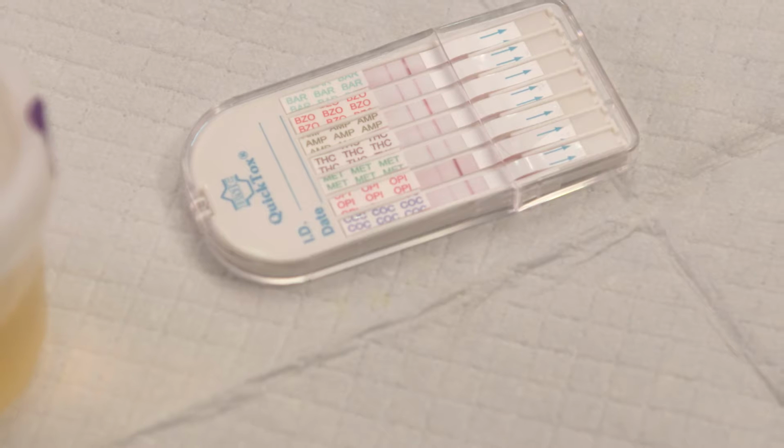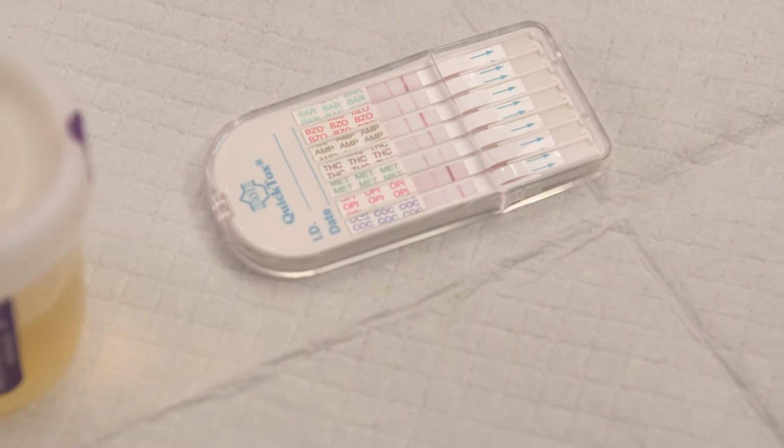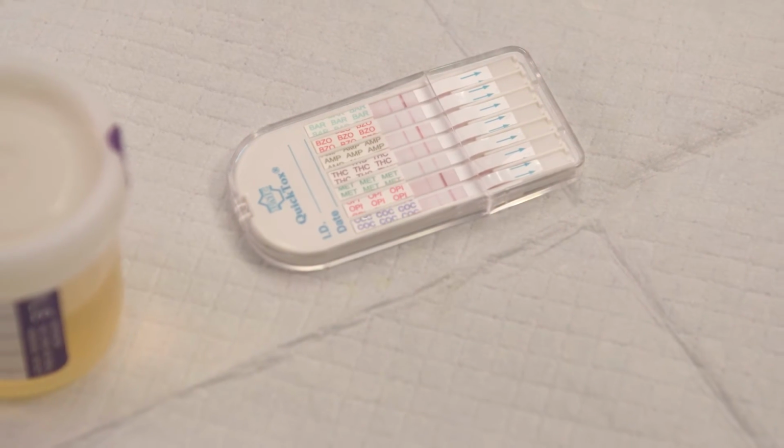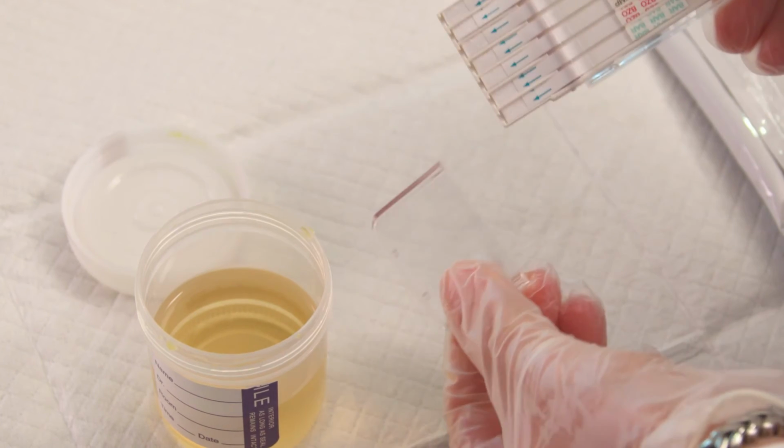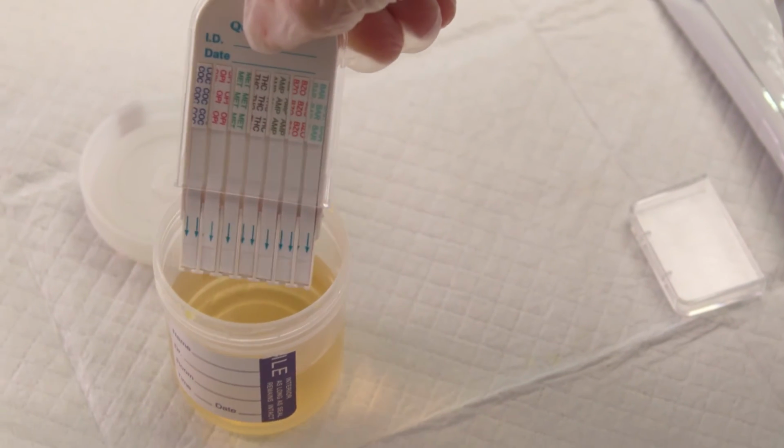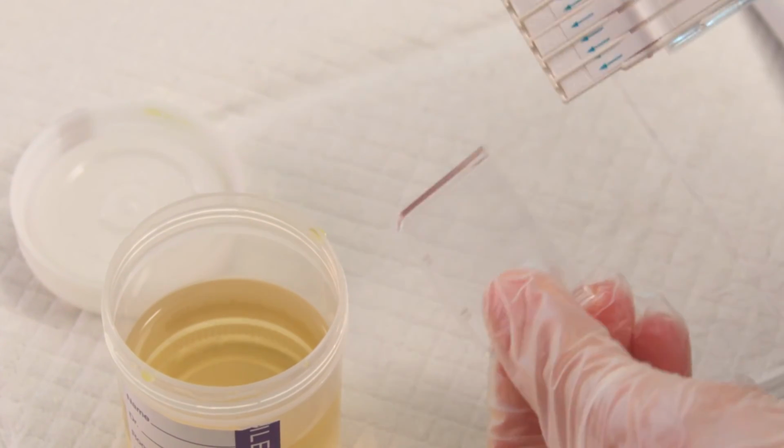Now, let's think for a minute about a few what-ifs. What if the participant reports no drug use, but the test shows a positive result? This can happen from time to time for several reasons. Check again to make sure the control line for the substance in question is visible. If visible, use your discretion. You may need to test the same urine sample again using a new dip card, preferably from another lot number. If the results change, the original dip card may have been faulty. A third test may be needed to verify the result.